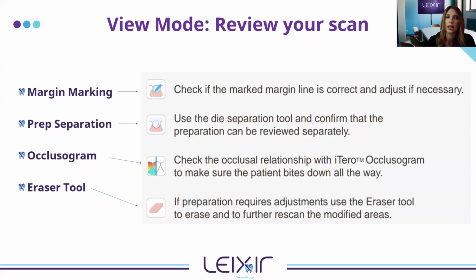We're going to hit that scan icon, which I will show you when we do the live scan here, so it makes a little more sense. And we will go back in and you'll see it circles just that area that we erased. And we're going to fill in just the data. It kind of looks similar if you're used to using the fill tool. Similar idea there.